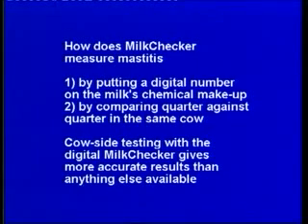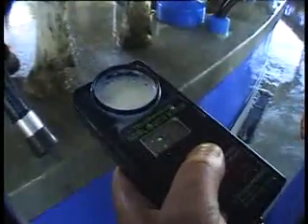Cow-side testing with the digital milkchecker gives more accurate results than anything else available. With the Technifarm digital mastitis detector, you test each quarter. Remember or write down the reading of each quarter and calculate the different margins between quarters. The greater the difference, the greater the infection level.